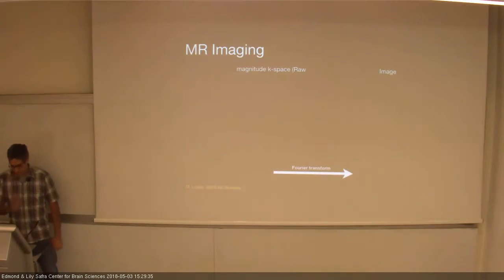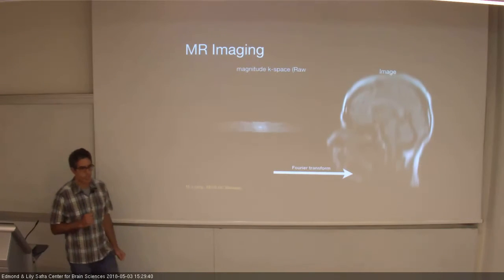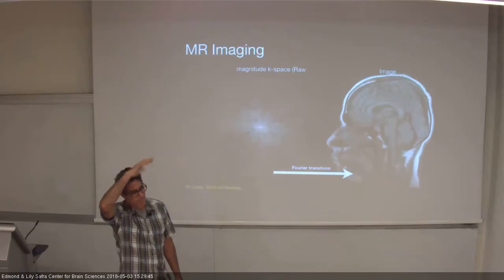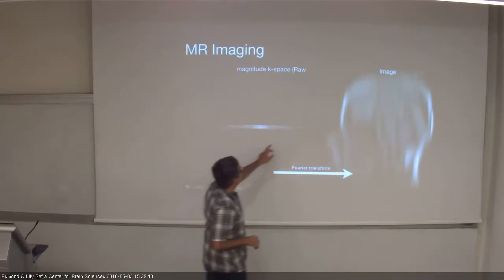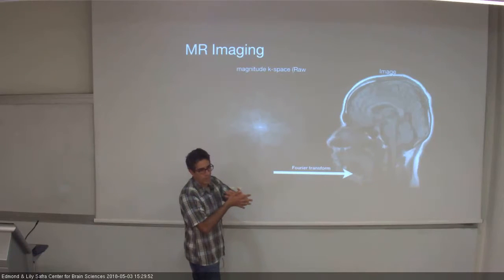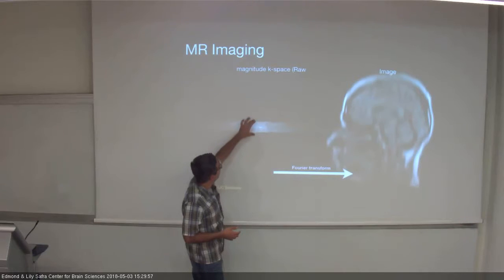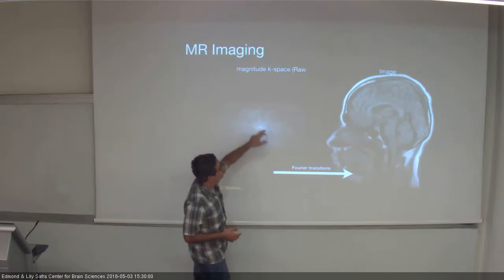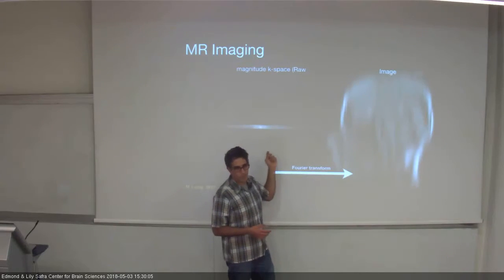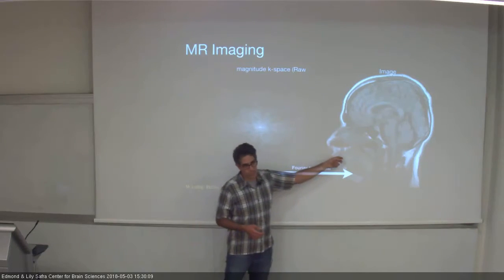Here is the movie I stole from Mickey Lustig, whose talk you saw. This is his work. He's working only on that, on how you play with this thing. So what happened in here? Here is the amplitude of different frequencies or different waveforms, and as we add them, we start with the low frequencies and we go out to higher frequencies. As we add them, we're getting an image. That's essentially the Fourier transform from the frequency space, which we call K space, because it's kx and ky, to the image space.